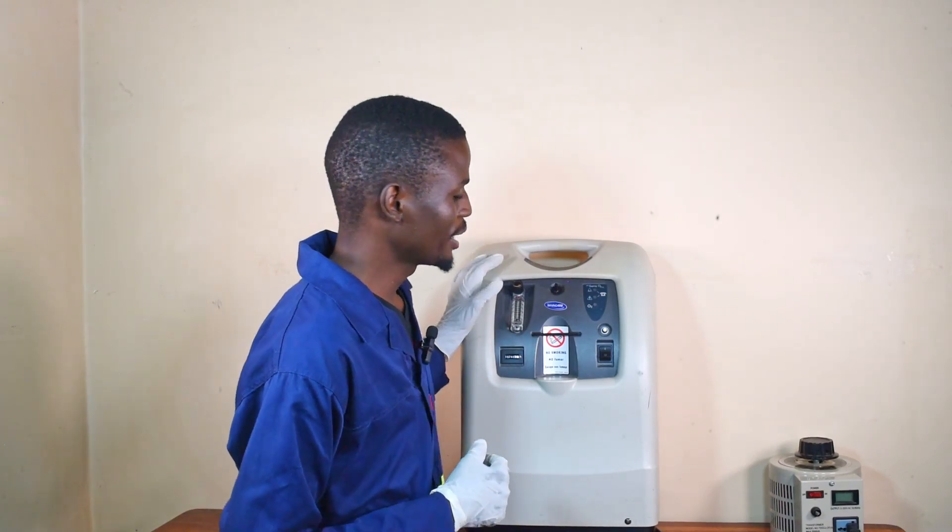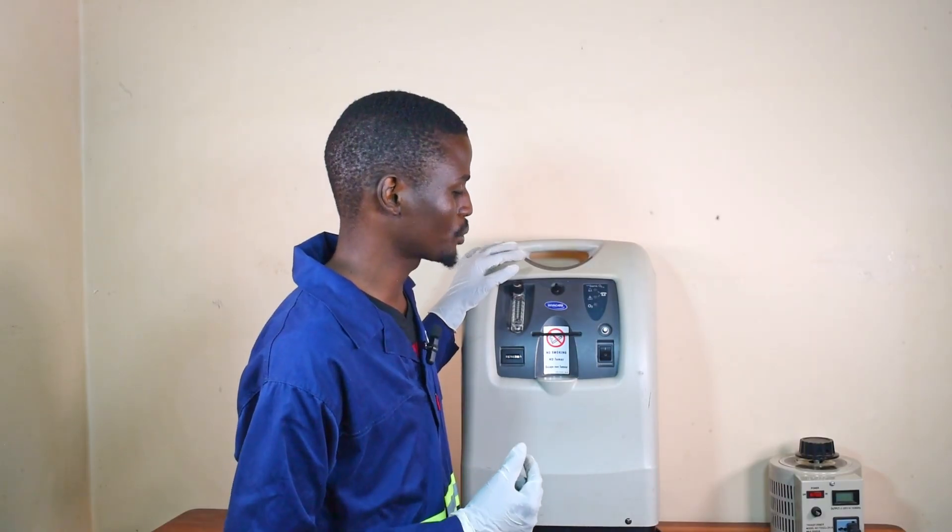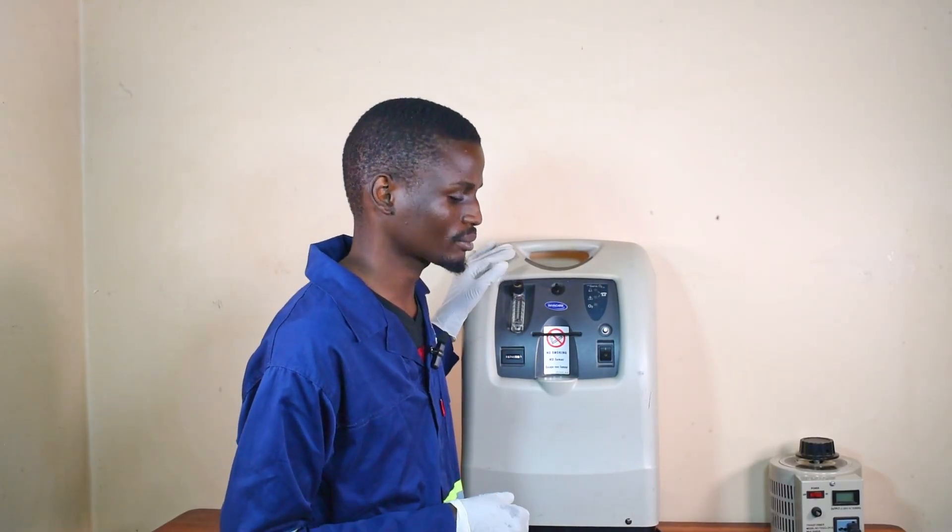As you can hear, a beeping alarm has been activated to signify that no power is being supplied to the oxygen concentrator. If the alarm does not activate after the power cutoff with the unit still turned on, it means that the battery-free alarm circuit is drained. Under normal conditions, the circuit should be automatically recharged once power is restored and the unit is turned on.